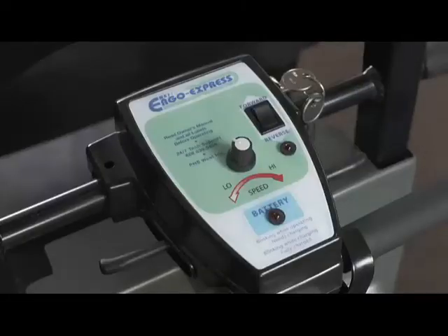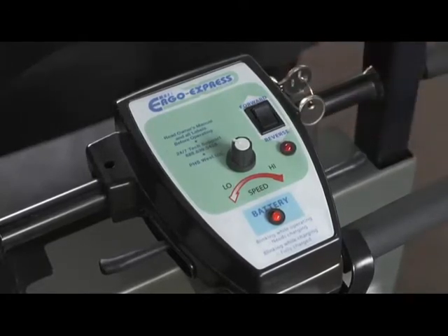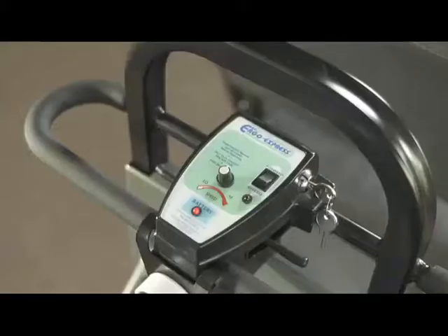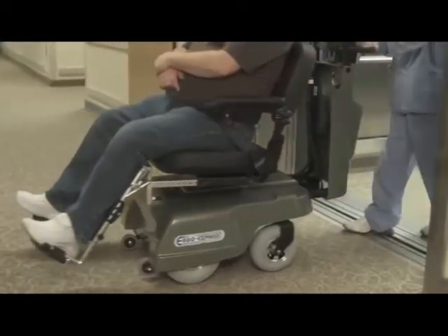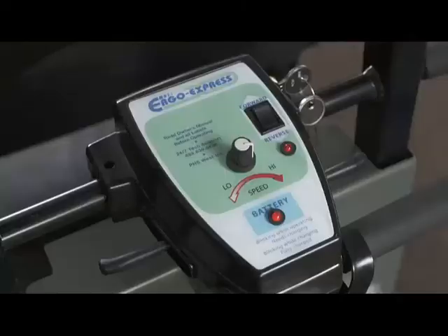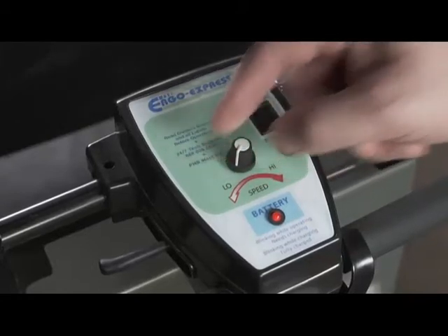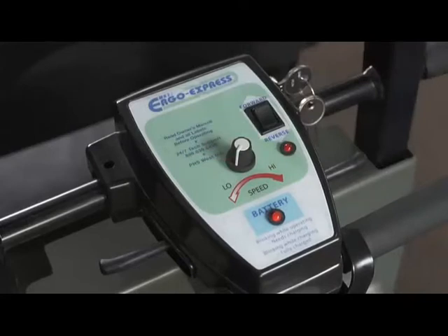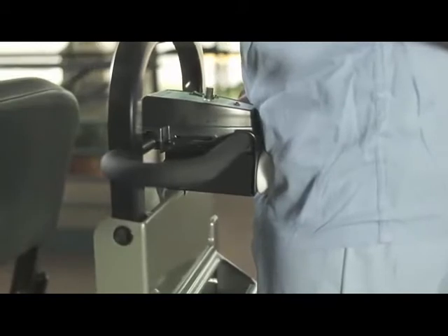First, familiarize yourself with the control panel. To turn the PTC on, turn the key switch in a counterclockwise direction. The battery light on the control panel will illuminate. The reverse LED indicates the direction the PTC will travel when you engage the throttle. The top speed control dial allows you to set the top speed of the PTC — turn it to the left for the slowest top speed and to the right for the fastest. The belly bump switch will stop the PTC immediately after being engaged.